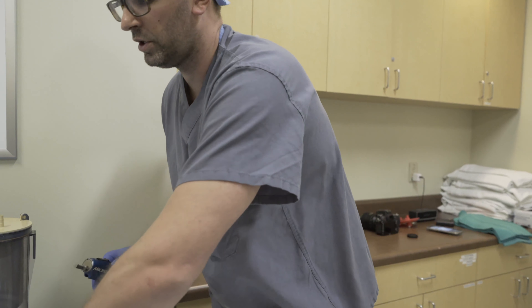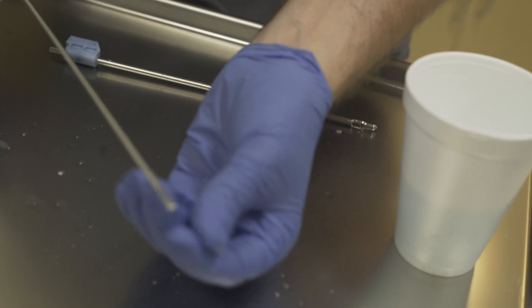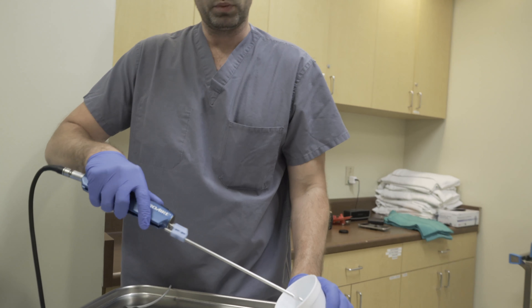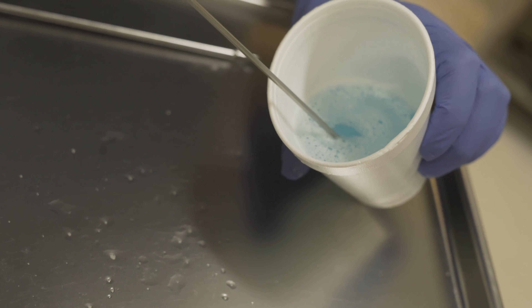But we're not done yet, because we want to make sure we don't get any irregularities or ripples from the liposuction. So we come through one more time with that basket cannula to take any remaining fat and break it up one last time. By doing that, it keeps the fat nice and even, nice and smooth, so we get a nice clean result.